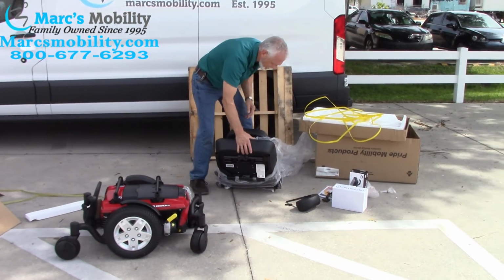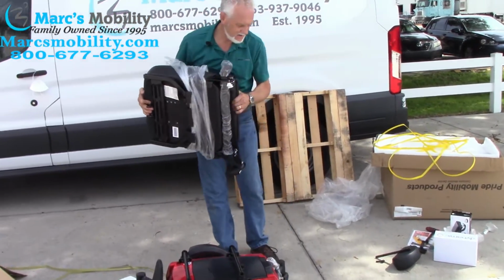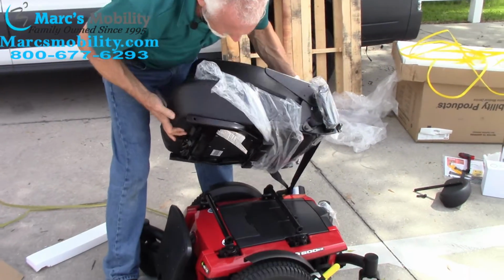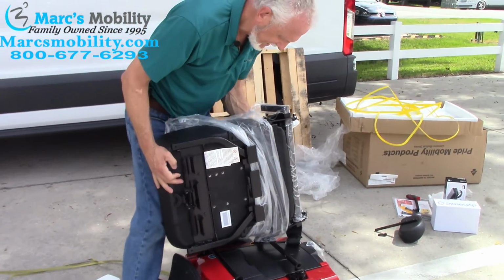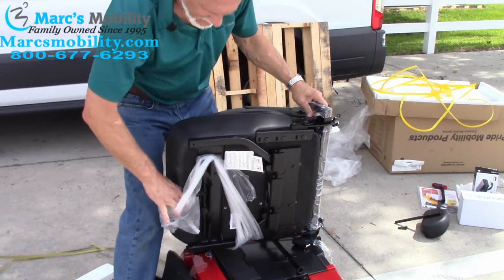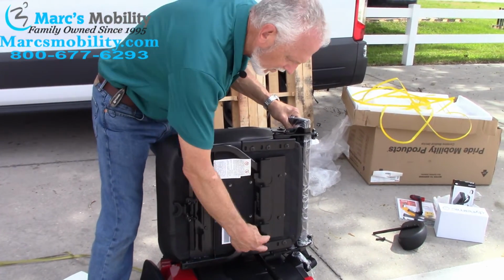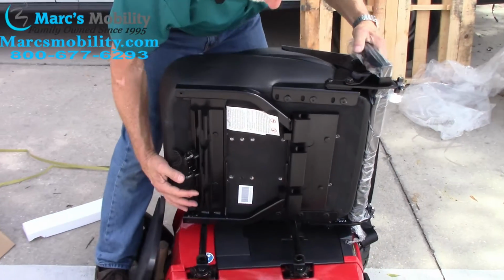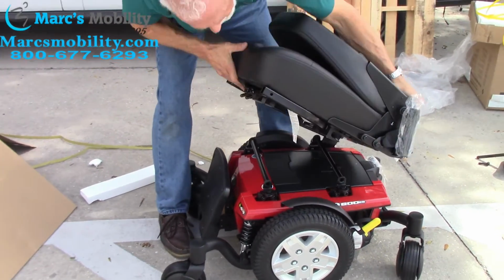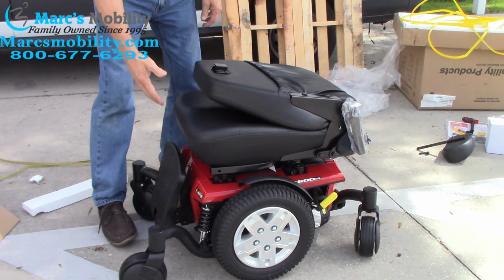All right, so I'm going to put the seat on the chair. You can see the back end. All right, the back end has to go in first. So if you watch, let me take this plastic off real quick here so we don't confuse anybody. All right. So this back end has to slide in here first. So you can see the groove in here. It goes in and then it locks on here. So if I put it this way, all right? It's already locked in.